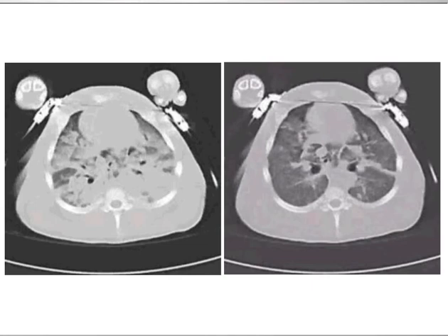We never had an impression that we really had a blood pressure fall doing these maneuvers. Both the blood pressure and the PaO2 need indwelling artery catheters, but the dynamic compliance and the VTCO2 can be seen on the ventilator continuously.